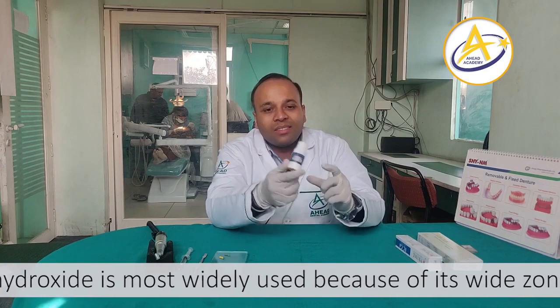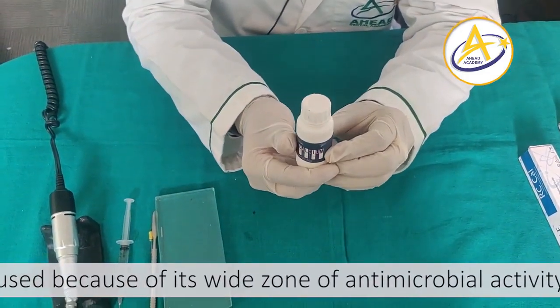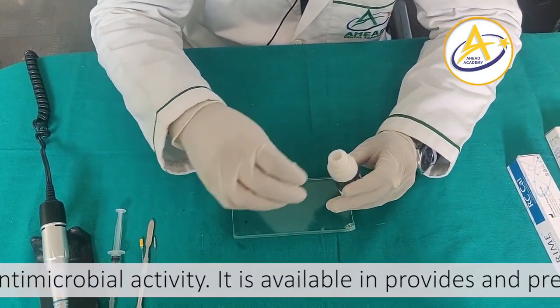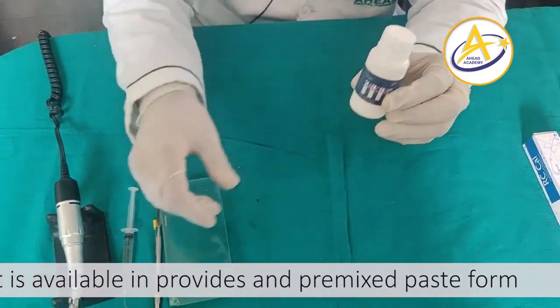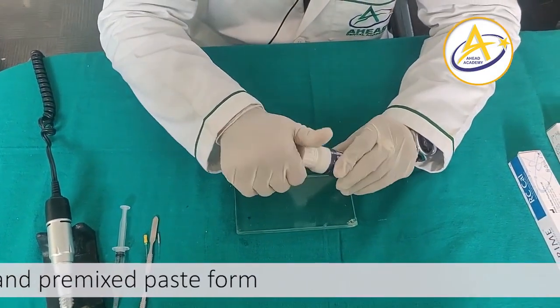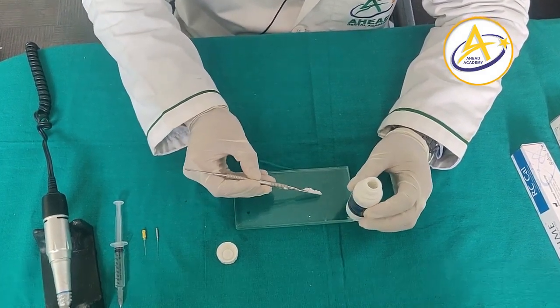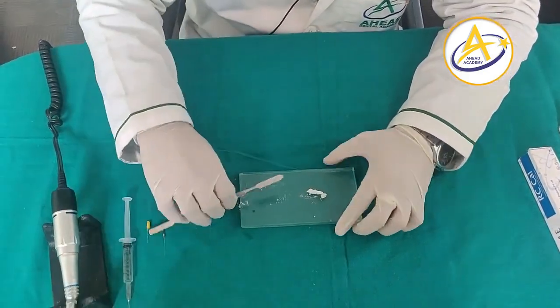Now let's discuss how to use calcium hydroxide in the powder form. We'll take a clean glass slab, shake the bottle of calcium hydroxide, and open it. We are going to take just a small scoop of calcium hydroxide like this, and then we will divide this into two parts.